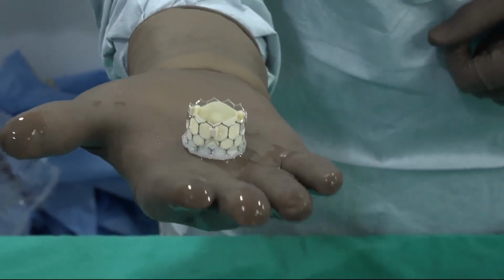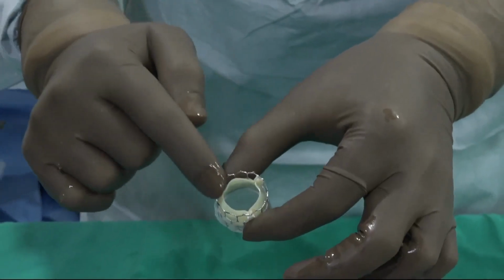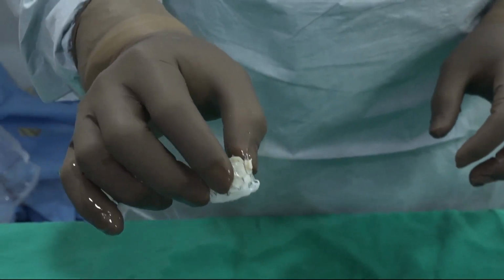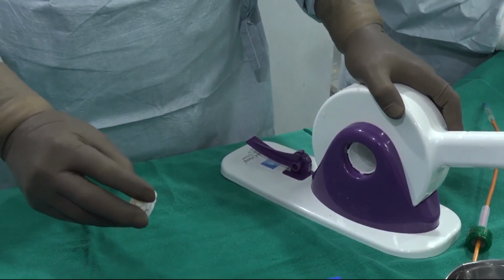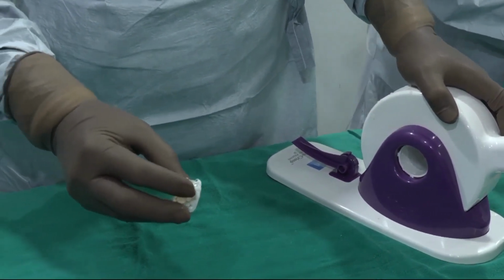That is the valve. These are the 3 commissures, and we will be trying to achieve commissural alignment with a special technique. We derive an angle on the CT on which we decide where the commissure post of the valve has to be crimped, in which angle.